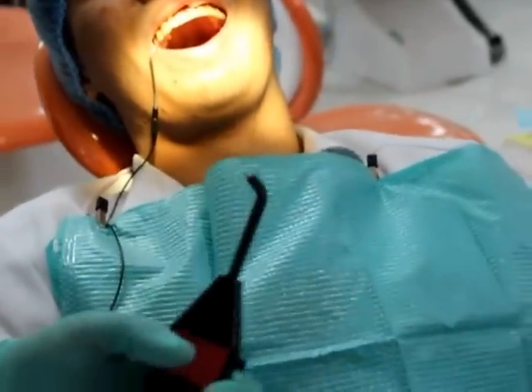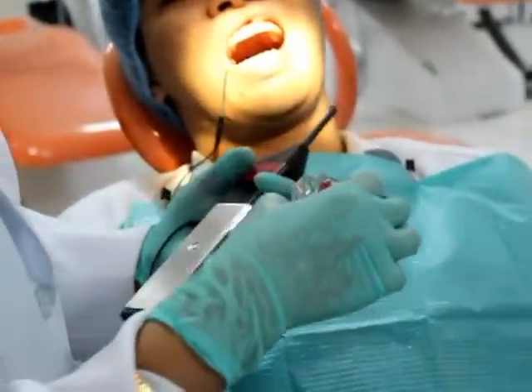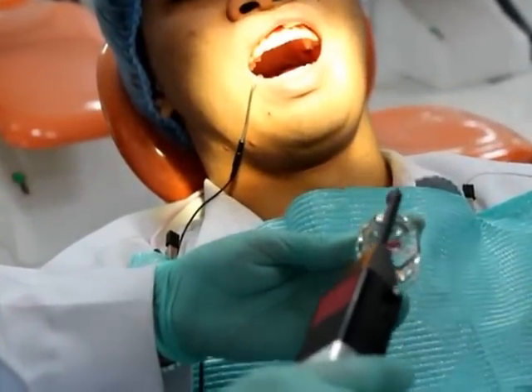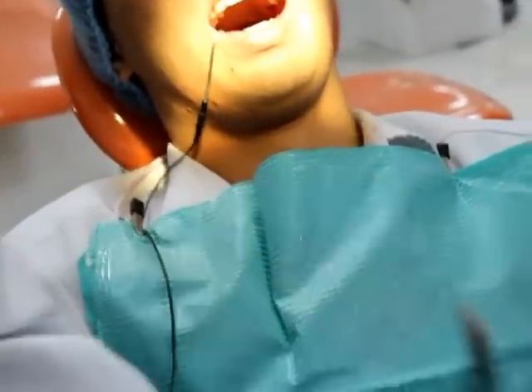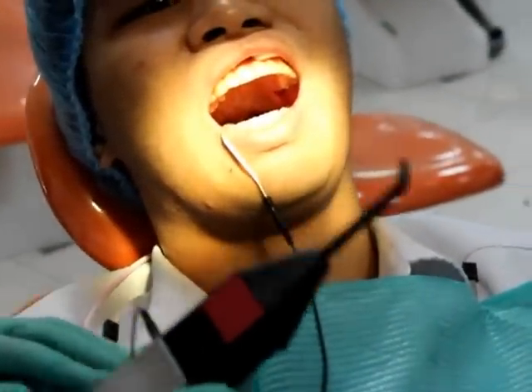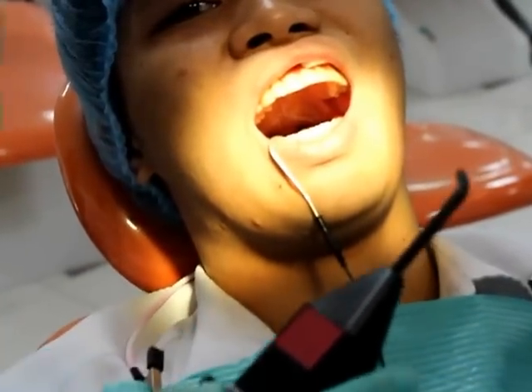Since you need a conductor, you need toothpaste. When you place the toothpaste, just get it from the tip. And then place it on the tooth. The instruction to the patient is, I'm going to place something. If you feel it, raise your right hand.